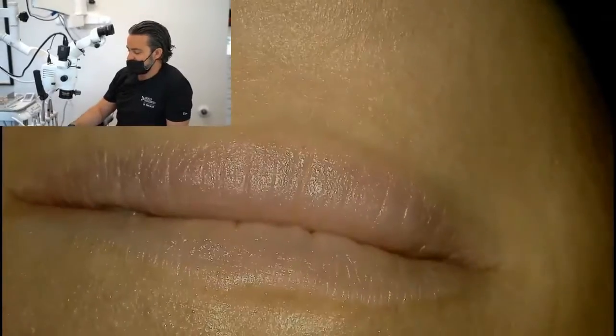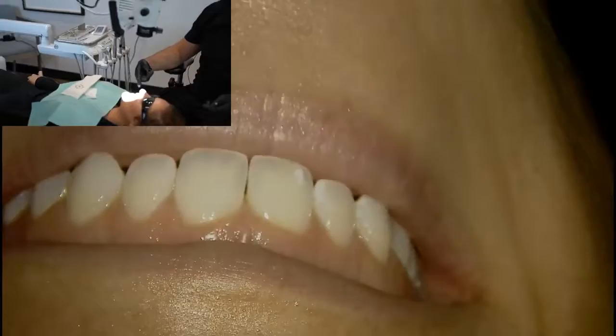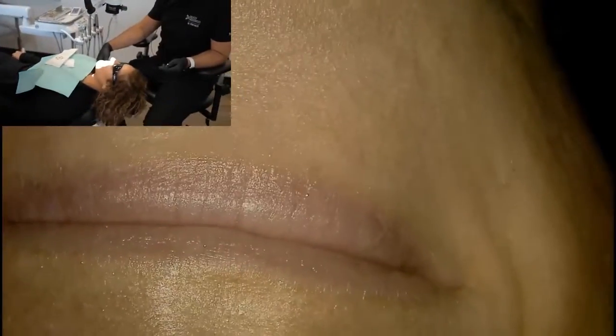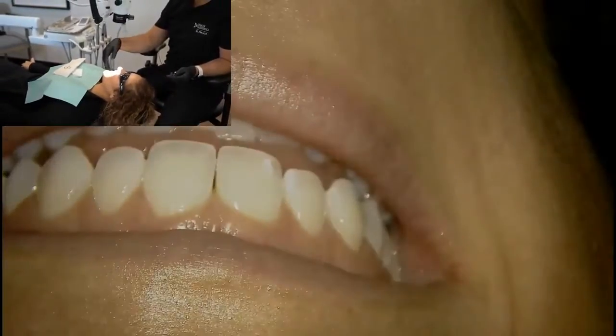Mm-hmm. Can you feel the heat? Mm-hmm. See, she's getting a suntan. Now, and this one's got the olive skin. She likes that. I think it's her Greek blood, whatever you are. You don't know. But you'll feel the warmth of that.